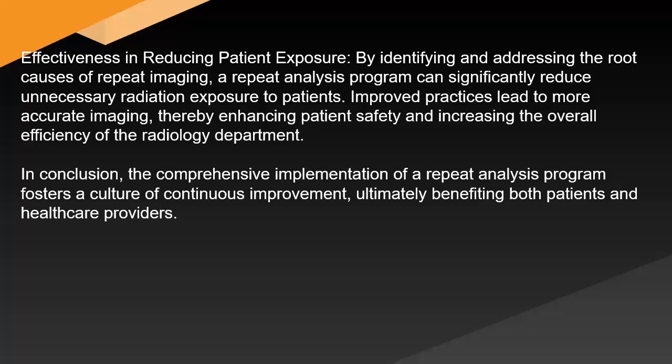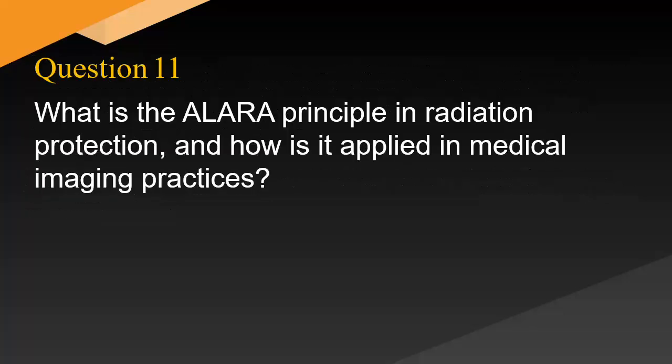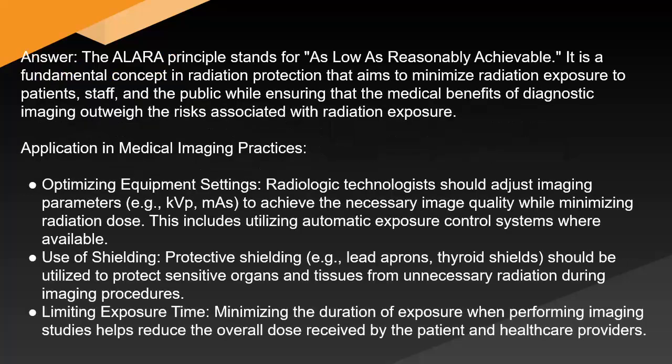radiology department. In conclusion, the comprehensive implementation of a repeat analysis program fosters a culture of continuous improvement, ultimately benefiting both patients and healthcare providers. What is the ALARA principle in radiation protection, and how is it applied in medical imaging practices? Answer: the ALARA principle stands for as low as reasonably achievable.